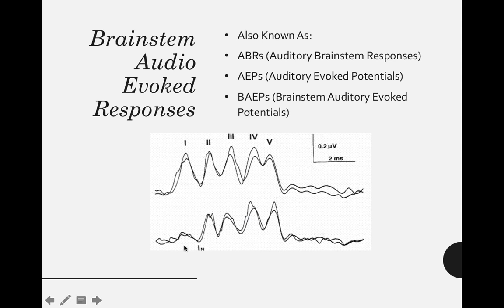And then this other one is the contralateral ear. It is the other ear. And we'll go into what the difference is between the two of them. But from just looking at it, you can see ipsilateral has got 5 waves and contralateral has got 4 waves. And this is for a specific reason that we will get into.